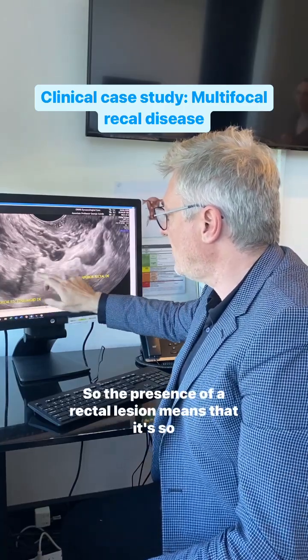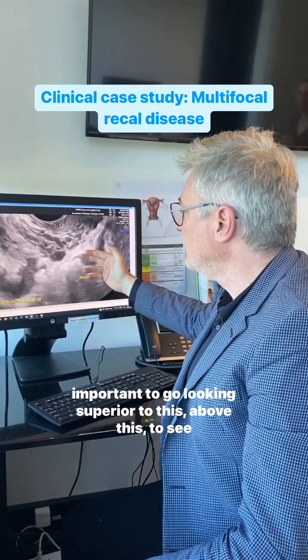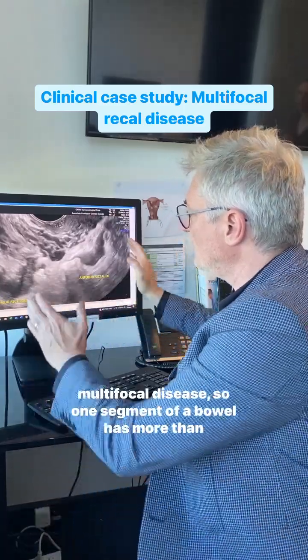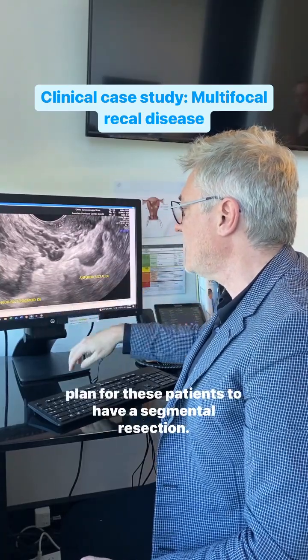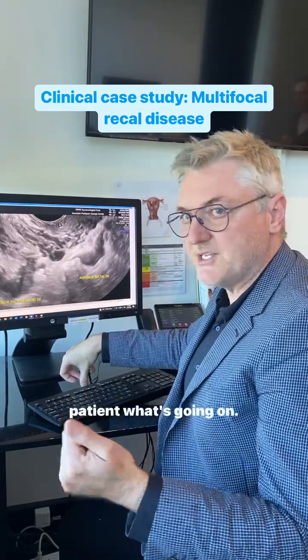So the presence of a rectal lesion means that it's so important to go looking superior to this, above this, to see if there's a second lesion. Because in a patient that's got multifocal disease, so one segment of the bowel has more than one lesion in it, for these patients that undergo surgery, we plan for a segmental resection. So this is important when it comes to explaining to the patient what's going on.